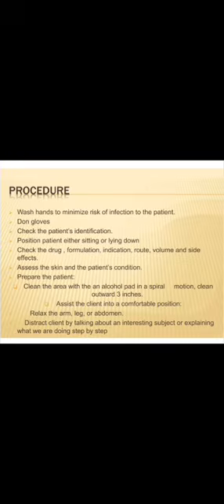Assist the client into a comfortable position, relax the arm, leg or abdomen, distract the client by talking about an interesting subject or explaining what we are doing step by step.